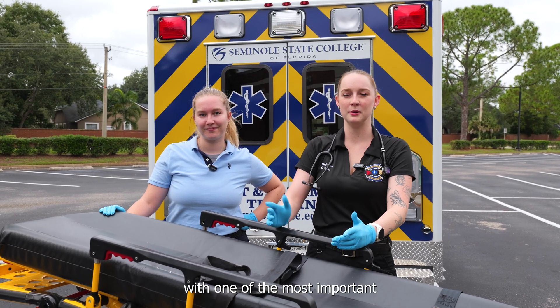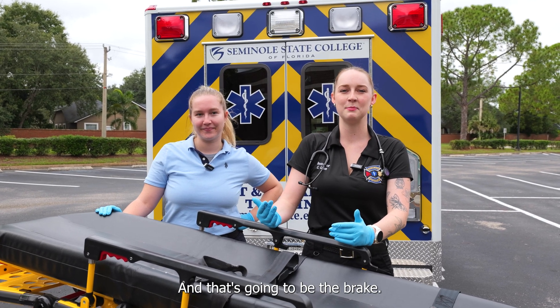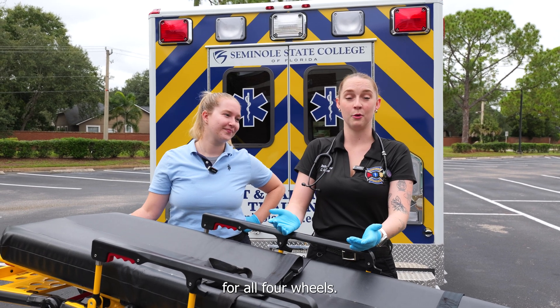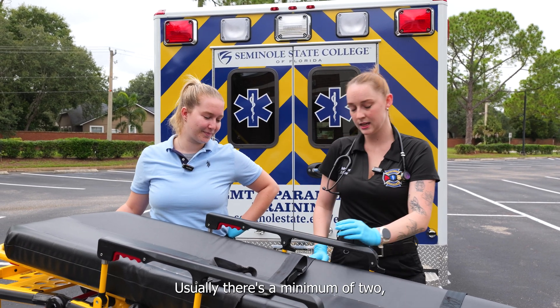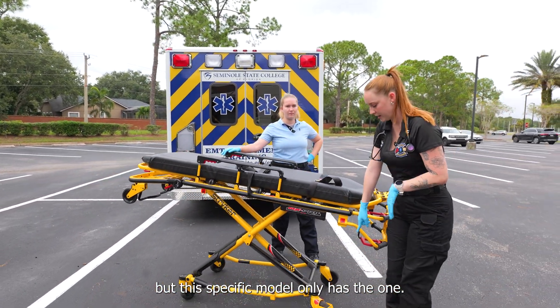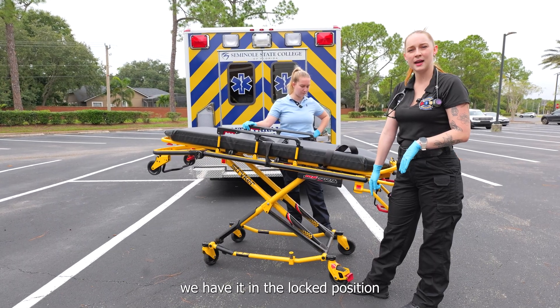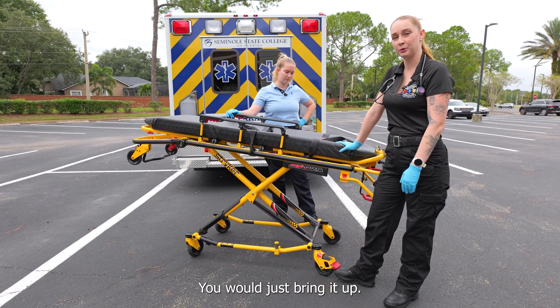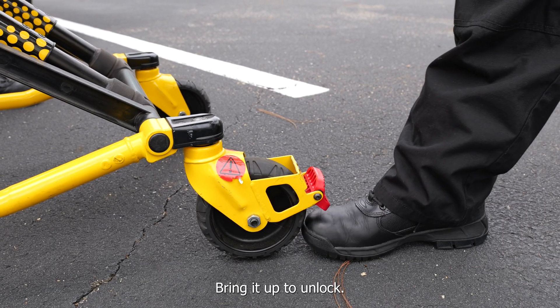We're going to start with one of the most important pieces of the stretcher and that's going to be the brake. This specific model only has one brake for all four wheels — keep that in mind. Usually there's a minimum of two, but this specific model only has the one. It's down here. Right now we have it in the locked position. To take it out of locked, you would just bring it up. So bring it down to brake, bring it up to unlock.